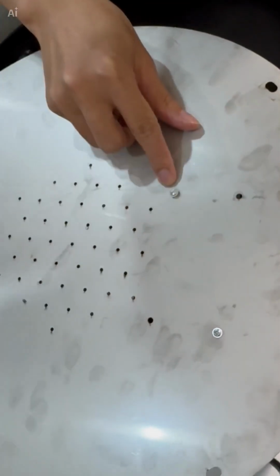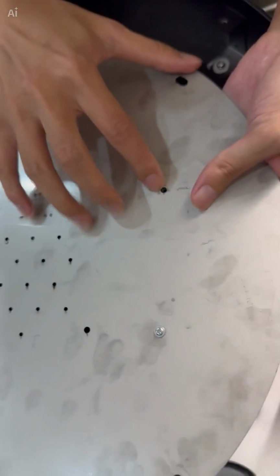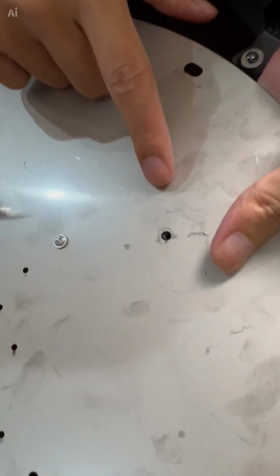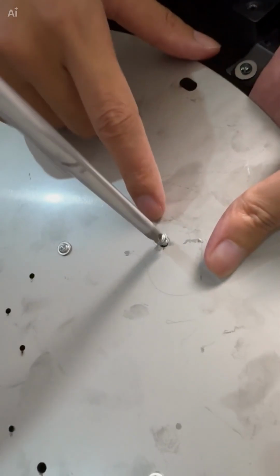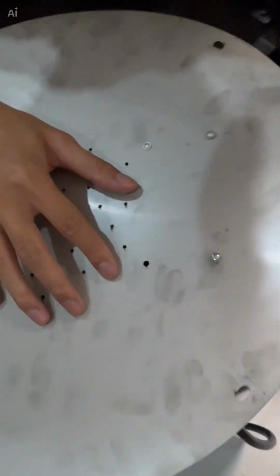Okay, this doesn't need to be locked too tightly, this one. Okay, start. Now, this hole, you can see the black plastic shell below is also aligned, this plastic shell. Then you can also lock this. Okay, then the last one.